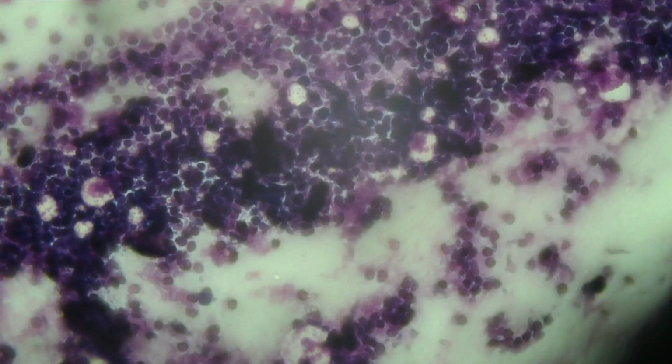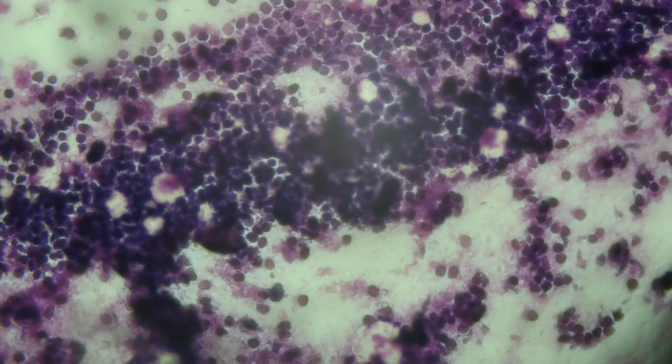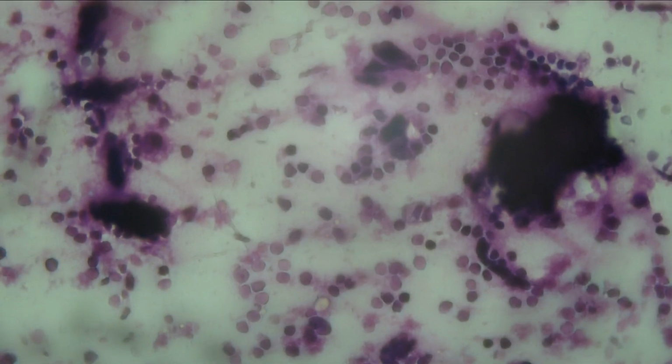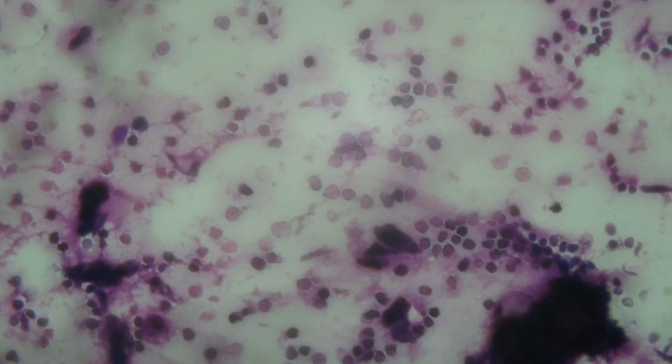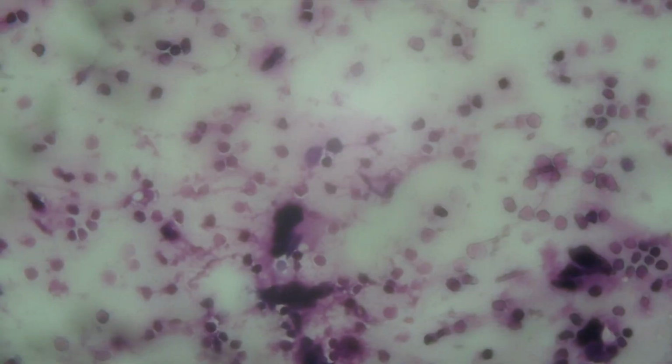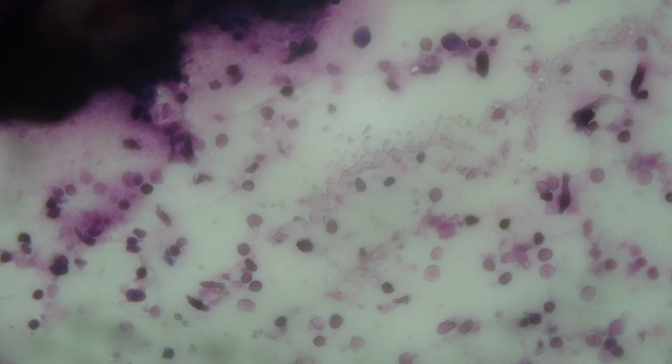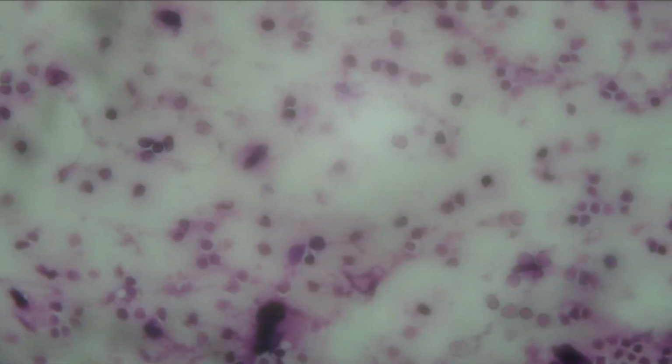I'll just scan. They're monomorphous almost. Yeah. They're staining blue. There's no salt and pepper appearance. Is that something that you would expect to see in neuroendocrine? Fried egg appearance, salt and pepper appearance. These are things that they talk about.